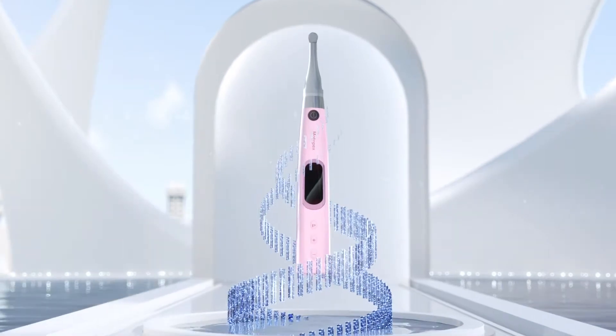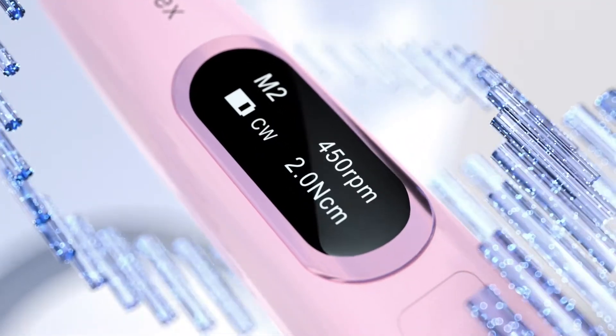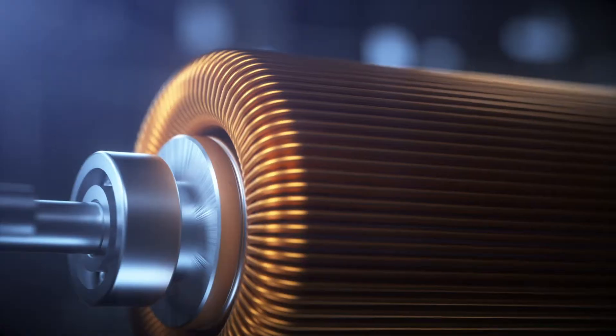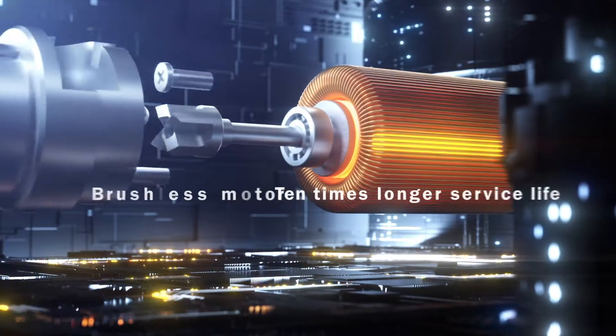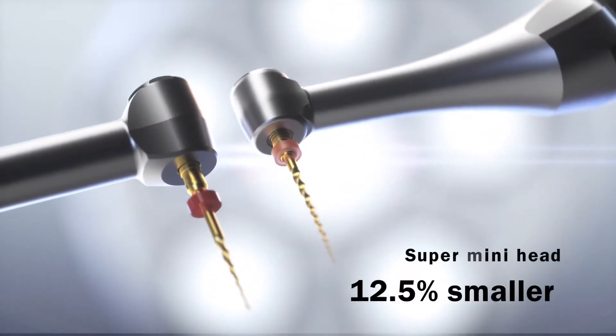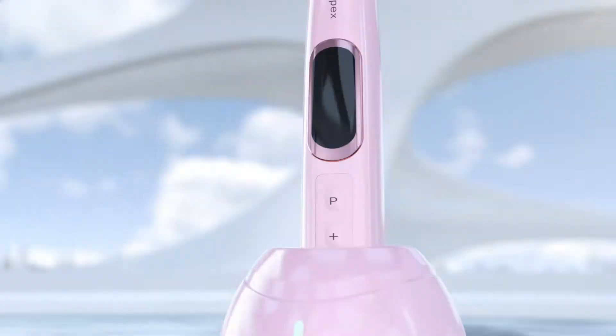I would like to begin with sharing some outstanding features of this endomotor. Firstly, it is lightweight, and this enables me to do several endodontic treatments and retreatments in a day without getting tired. Secondly, this endomotor is extremely silent, and this helps in minimizing fear in worried patients.